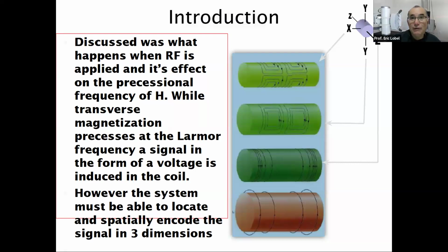They can flow in one direction, a positive polarity, or in the other direction, a negative polarity. However, Faraday's law says this flow of electrons, so a moving current, will yield magnetism. So the gradients are like leaf blowers, and they can throw out a magnetic field, a small one, right, compared to the main magnetic field.